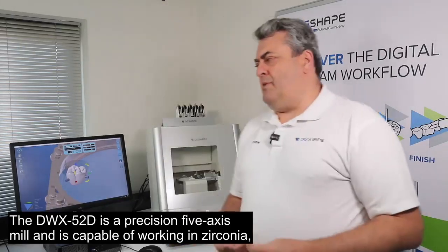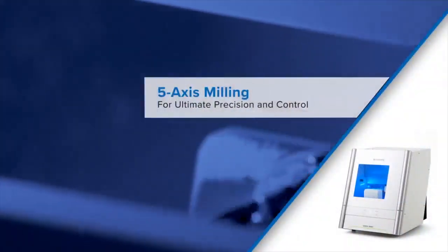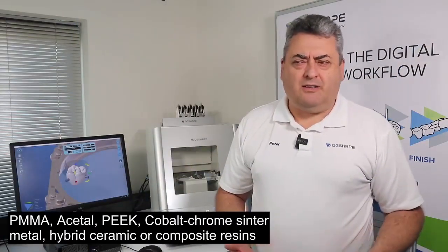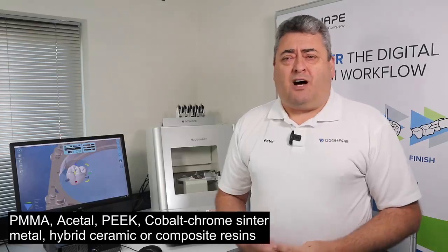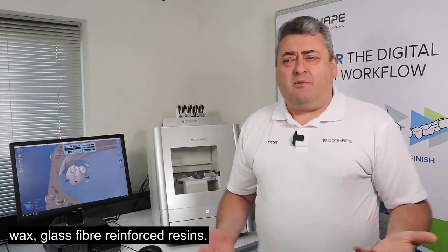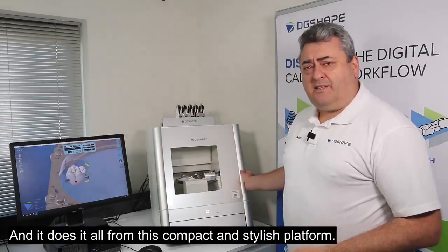The DWX-52D is a precision five-axis mill, capable of working in zirconia, wax, PMMA, acetal, PEEK, cobalt chrome sinter metal, hybrid ceramics or composite resins, and glass fibre reinforced resins — and it does it all from this compact and stylish platform.